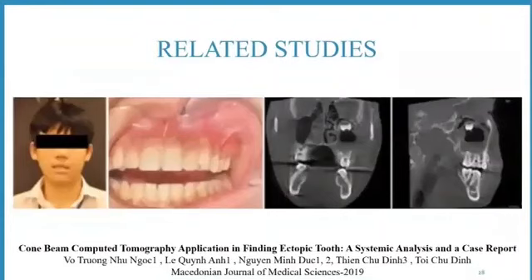Coming on to the next study, this article describes one orthodontic case in which an ectopic tooth in the maxillary sinus was found accidentally by inspecting the CBCT images. A 15-year-old male patient had reported with an orthodontic requirement but accompanied with mild pain and recurrent pus discharge from his left maxillary sinus since the last 1 year. Symptoms reduced with antibiotics, but then they recurred again after 1 to 2 weeks. The patient also reported stuffy nose and congestion. There was no history of systemic disorder or maxillofacial trauma.